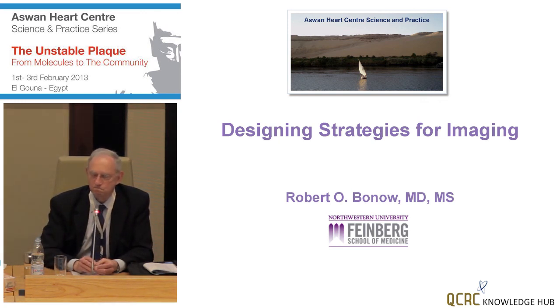I have another question related to the ideal method of imaging plaque erosion. We are accustomed to diagnose it if we find a thrombus burden without an underlying ruptured plaque, so we assume that there is a plaque erosion. Now we are being told that there are new imaging modalities, including OCT, that can have a good resolving power to diagnose it. So what's the sensitivity?